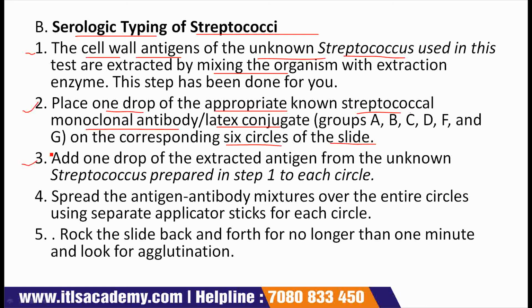Next point, add 1 drop of the extracted antigen from the unknown streptococcus prepared in step 1 to each circle.